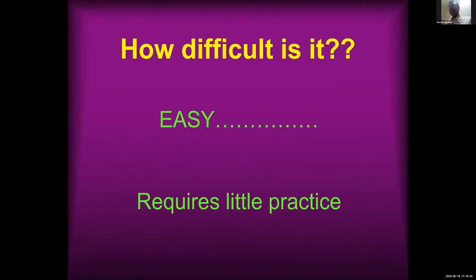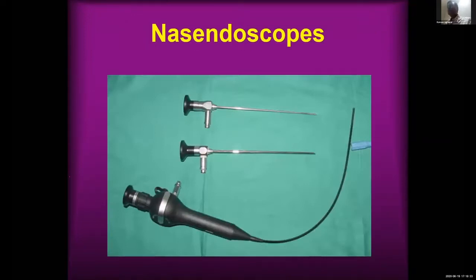Now, most of the time, the people who come for the training or when we present this, the commonest question asked is how difficult it is. Nasendoscopy is very simple, as Dr. Mukund presented. It's very easy. You have to go only 10 centimeters inside the nose and you can visualize it. But it requires practice. It requires little experience. It has got a short learning curve.